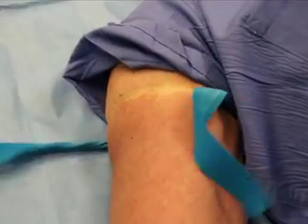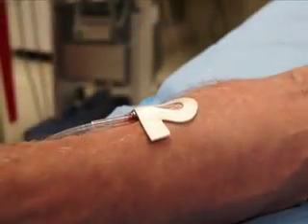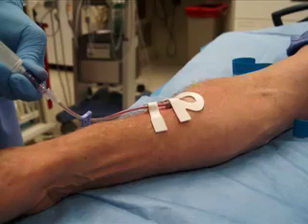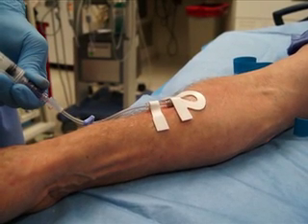Remove the tourniquet. Place the Luer lock adapter on the end of the catheter. Anchor the catheter, adapter, and connection tubing to the skin using adhesive dressing. Flush the catheter with sterile saline. The flush should flow smoothly into the catheter. If there is resistance, the catheter may be kinked, occluded, or outside the vein. Look for signs of extravasation, such as pain, swelling, or blanching.